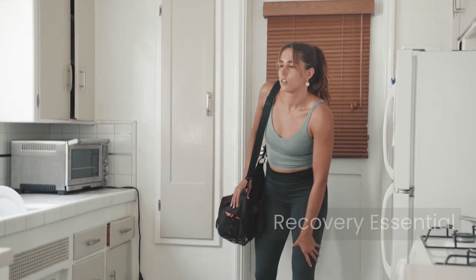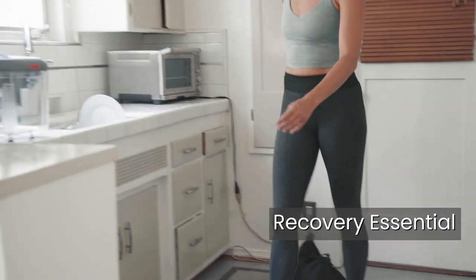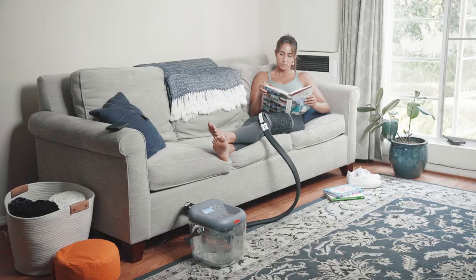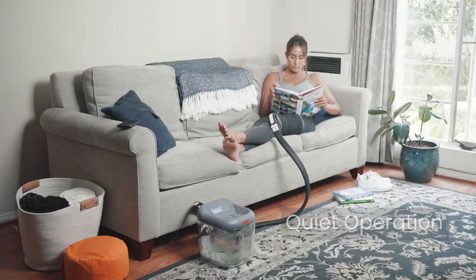Designed to provide immediate cooling relief from soreness, pain, and discomfort, the Vive Ice Therapy Machine is the perfect recovery essential. The Ice Therapy Machine allows you to be at ease during sessions with quiet operation.